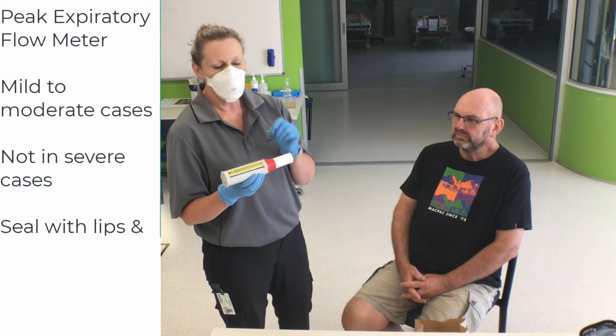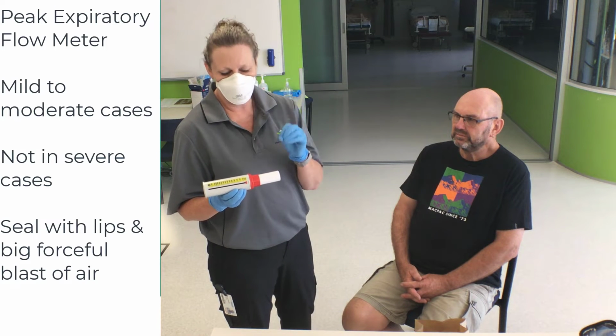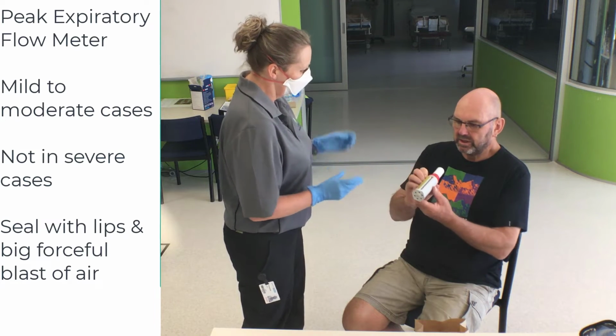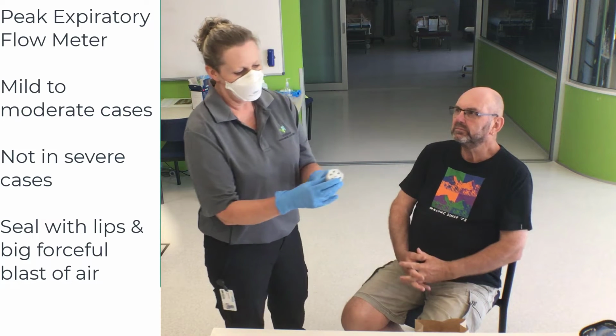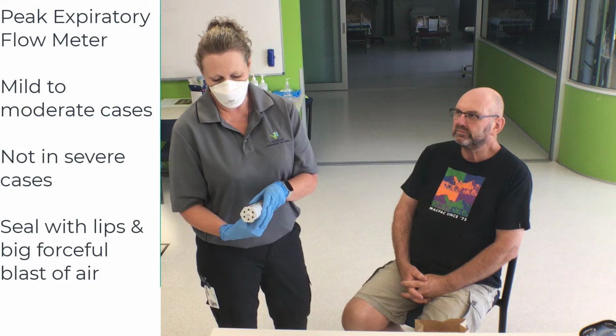and we ask Don to put his lips around the PEF, and then he's going to blow in a short, sharp burst as hard as he can. So could you blow into that machine short and sharp as hard as you can? Okay, so Don here has got 600, which is exceptional.